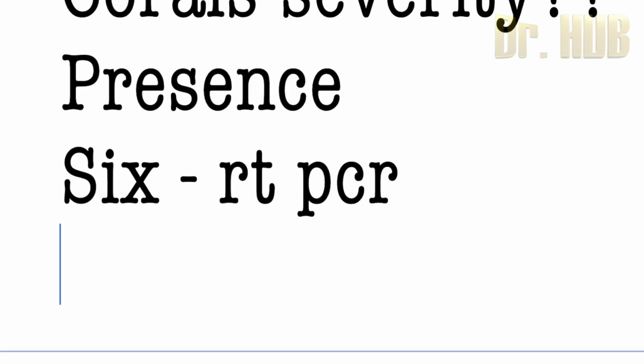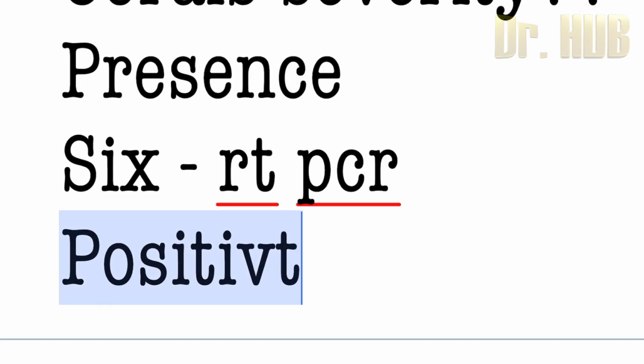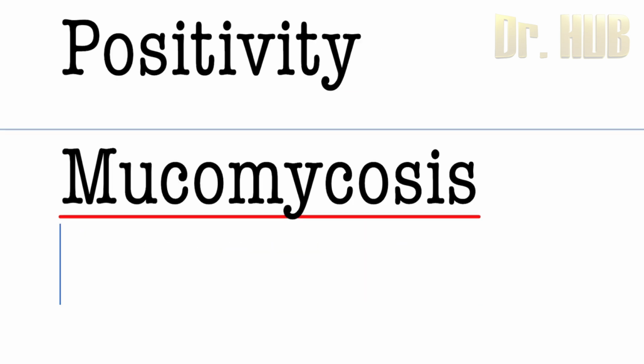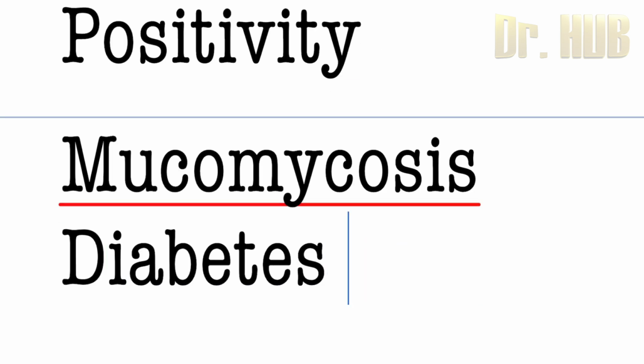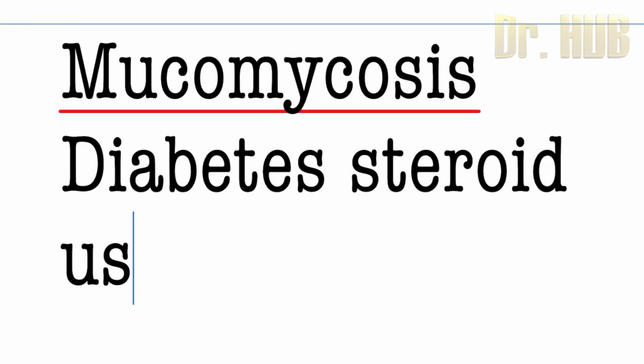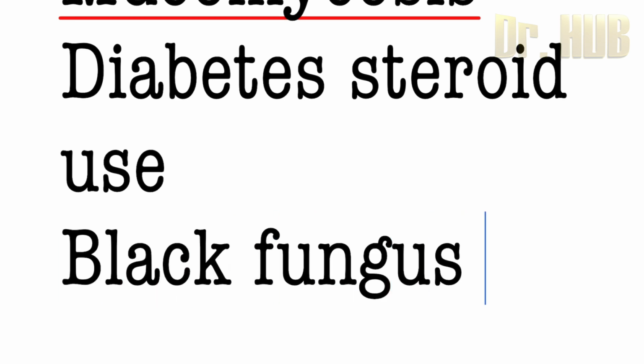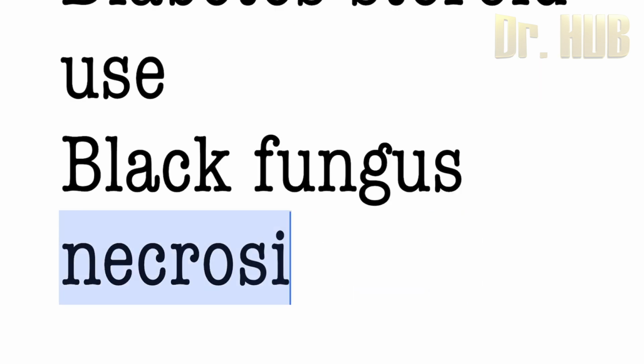When you look at CO-RADS 6, it is suggestive of RT-PCR positivity. And then comes mucormycosis, especially in cases of diabetes and the presence of steroid use. Then comes the black fungus. The black fungus is present due to the necrosis.